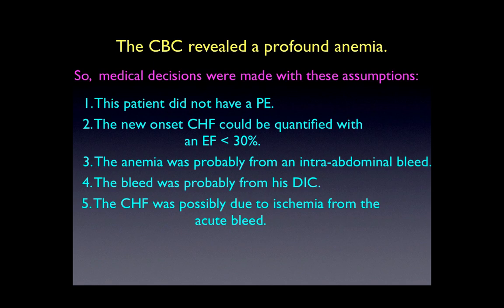Obviously, this would change your clinical management: whether to call surgery for the abdominal bleed, how much fluid to give, whether you wanted to give inotropes. Many decisions could be made based upon this ultrasound, based upon both ultrasounds.